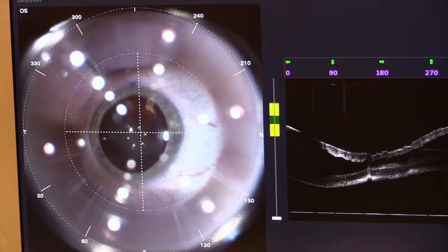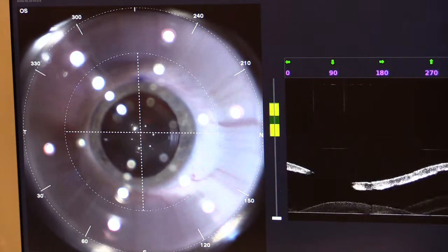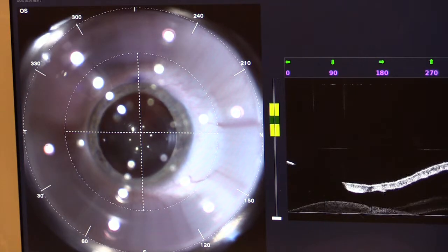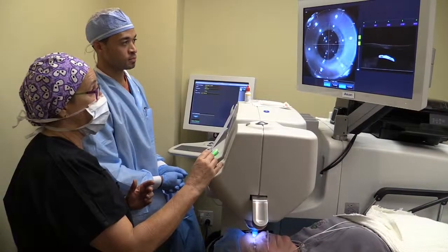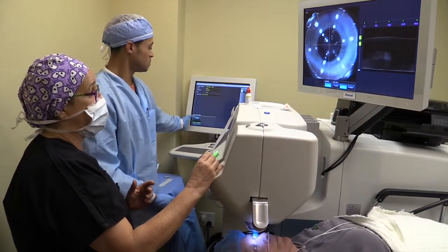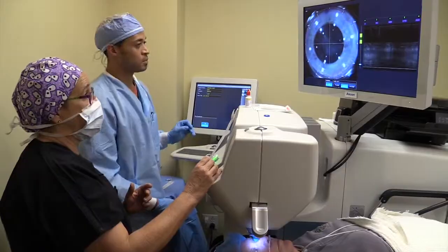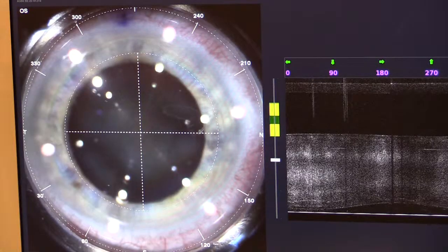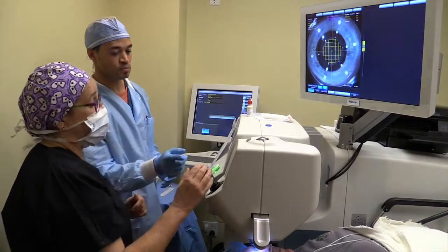We will now go on down into our docking procedure. Please look into the ring of lights there for me, Ms. Brown. That's perfect. You've got it. Stand by. Go. Now it's created a mild suction, and we're bringing that right up into place. Now you'll start looking at your screen pattern. Okay.